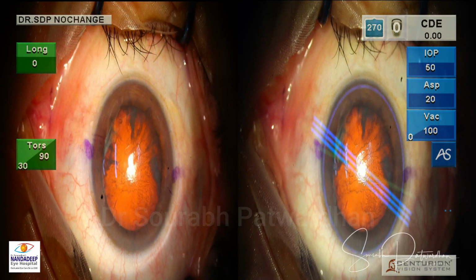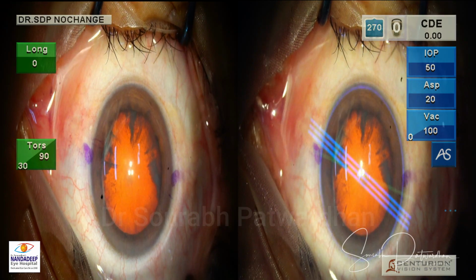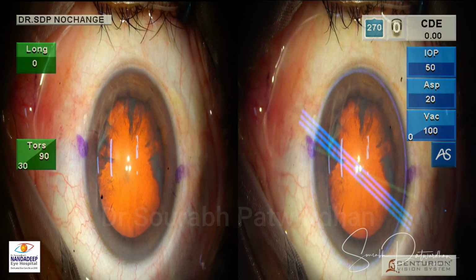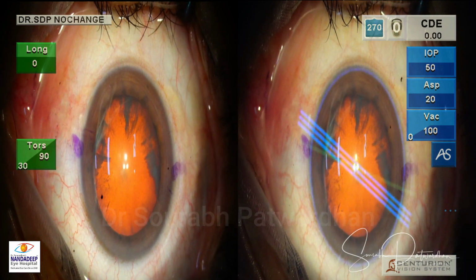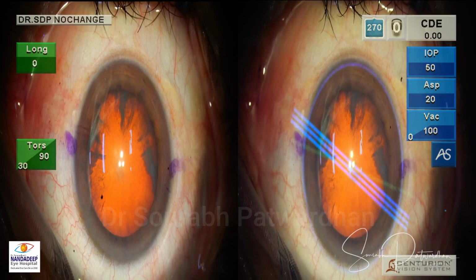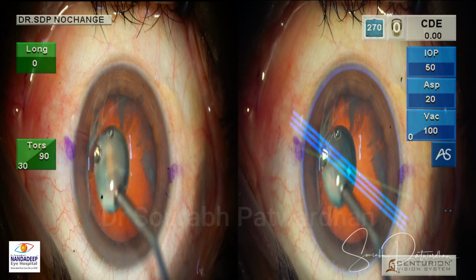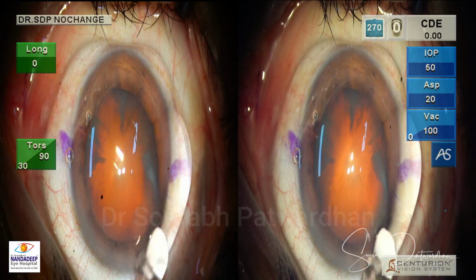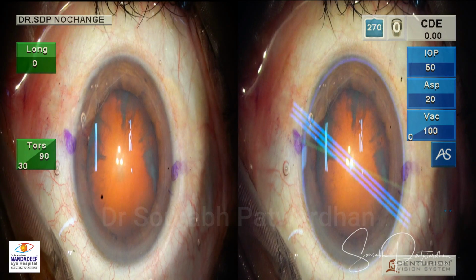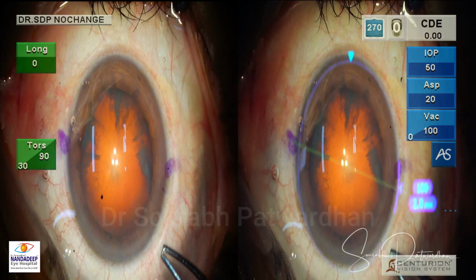And you can see it is almost close to the Callisto. Just maybe 2 or 3 degrees difference. You can see that in the hall. Dr. Lahoti? Yes, sir. So even if you don't have these gadgets, you can easily mark simply with iToric. Not even a slit lamp, nothing is required, and you can get almost perfect axis. Okay, so I will start with the surgery.